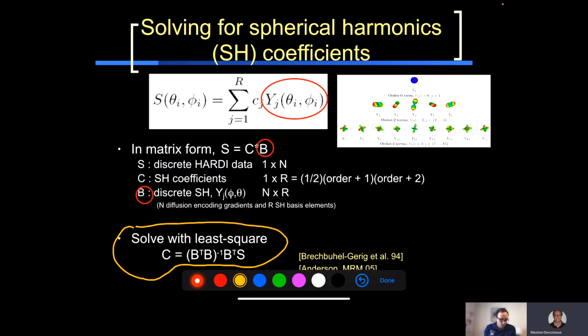And so this is a great way to go from any sphere to the basis, and then to also go to another sphere, let's say for visualization. You'll see that in my demo, but with this tool, it's easy to start from, let's say, DTI data from 32 directions, go onto the spherical harmonics basis of 15 coefficients, and then project back to, let's say, 5,000 points on the sphere to have a sexy visualization. Because only this B matrix will do the trick of extrapolating data to a bigger sphere, if you wish.